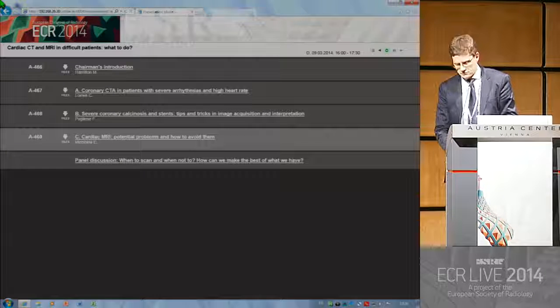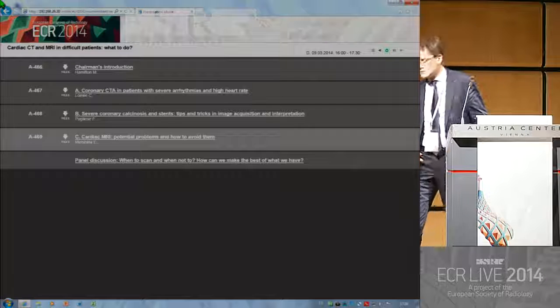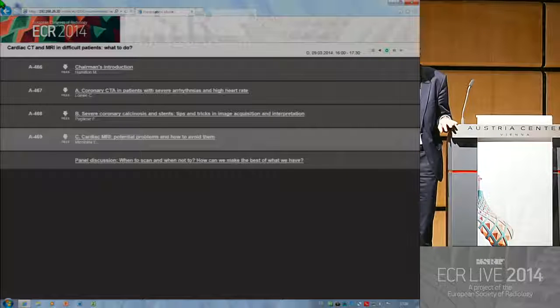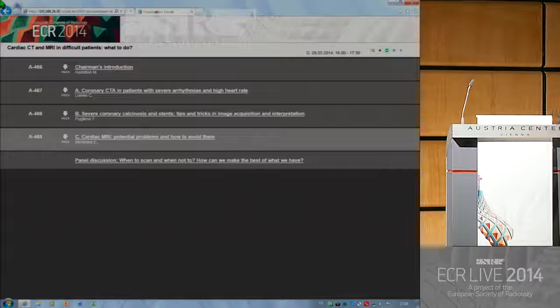Thank you. As the moderator, unless there are any further questions, I'll take the privilege of having the final word, and this is that the most difficult thing about ECG gating is finding the ECG leads. Just go and get them from the cupboard, plug them in, and the scanner will do a beautiful thoracic aorta in an on-call situation.